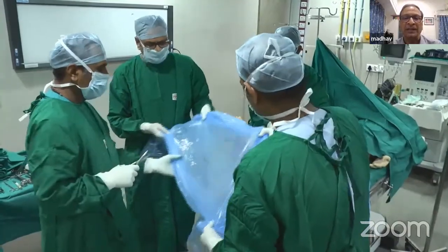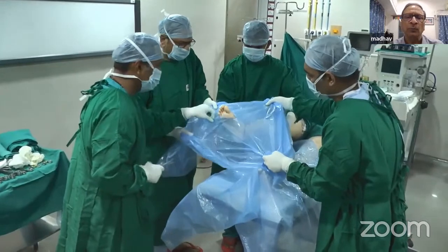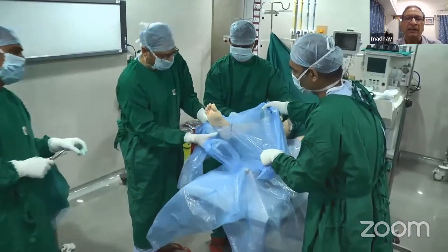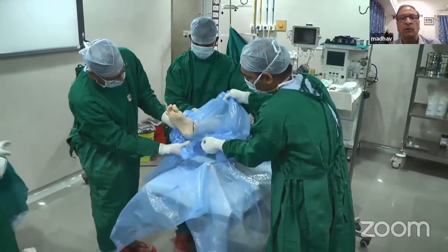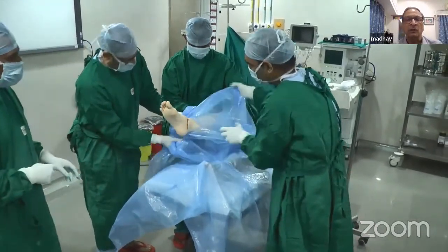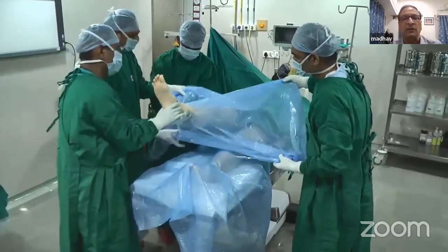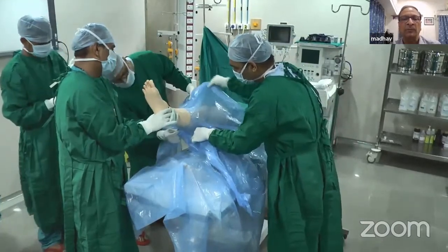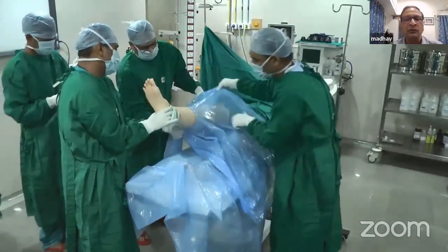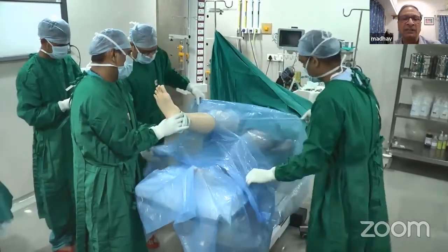Once you have threaded the foot through the small hole, you pull the sheet up the leg till you isolate the amount of leg that you want to keep open, which keeps the operating area open. Because the leg becomes wider as you go up, as you pull the sheet up, it automatically tears and accommodates the leg.